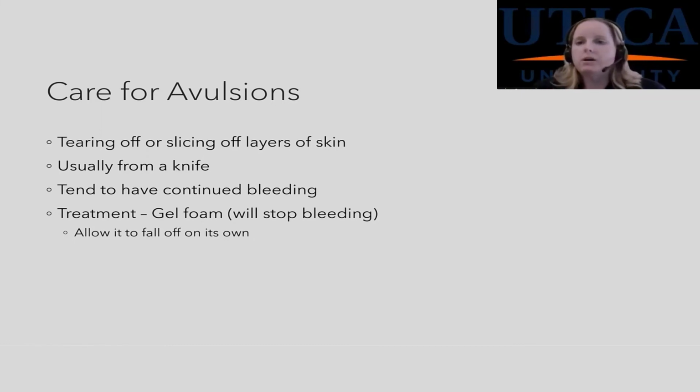If you take 1% with epinephrine, put it on some gauze, and have them hold it on that area, not for more than 30 minutes, just topically, and then take it off and put the gel foam on. That seems to be my little trick of the day. I know you're not supposed to put it on digits, but just for a short period of time topically, that seems to be the ticket to get it to stop bleeding. And this is only for people that bleed through everything and are bleeding through the gel foam that you cannot get to stop bleeding.